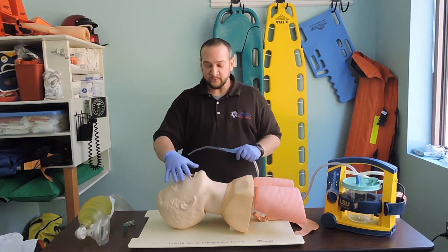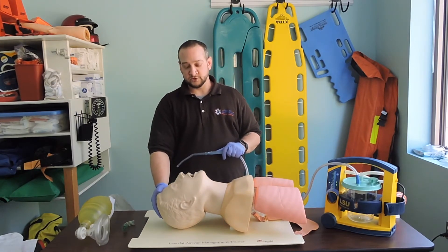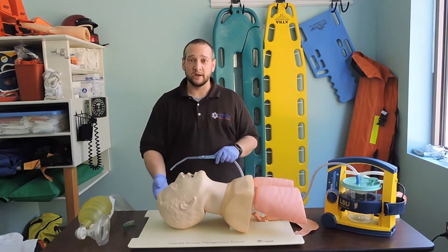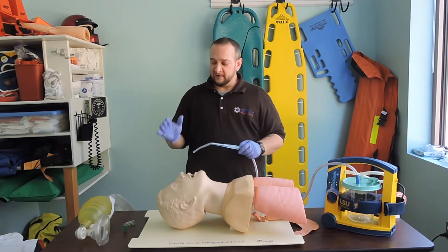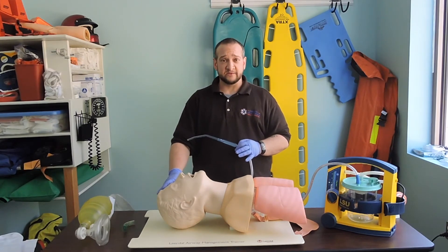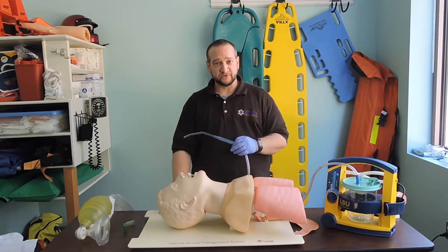We don't want to suction longer than 10 seconds because while we're suctioning, we're depriving our patient of oxygen. If there was a lot of thick vomitus and we couldn't clear the airway or the patient was actively vomiting, then we would continue longer. But for clearing most obstructions, a good rule is no longer than 10 seconds — then immediately get back to ventilating or providing supplemental oxygen.